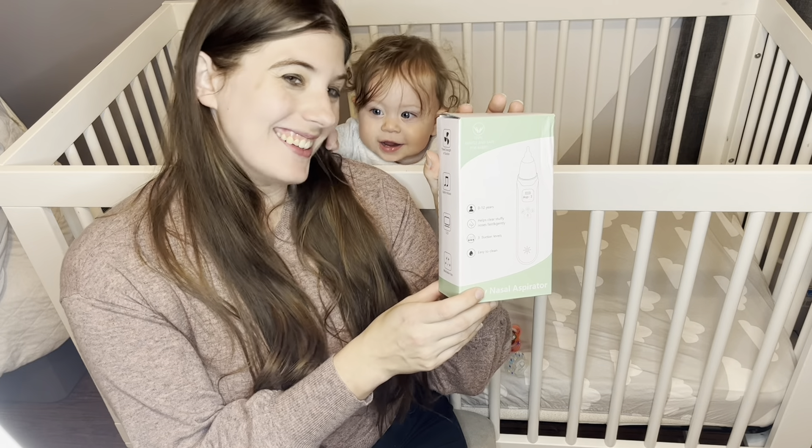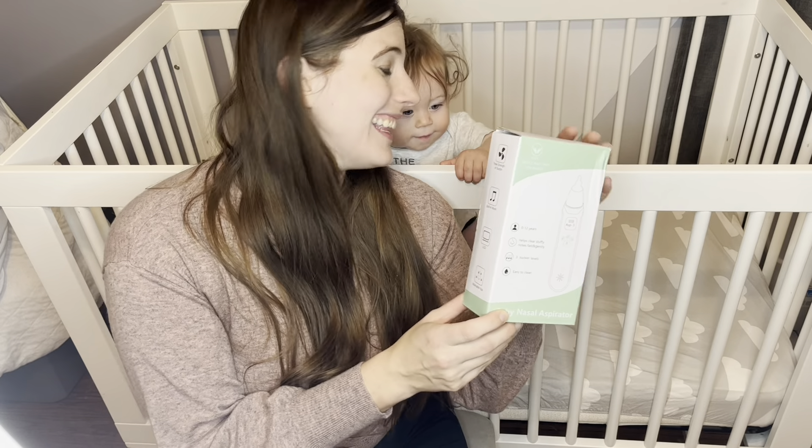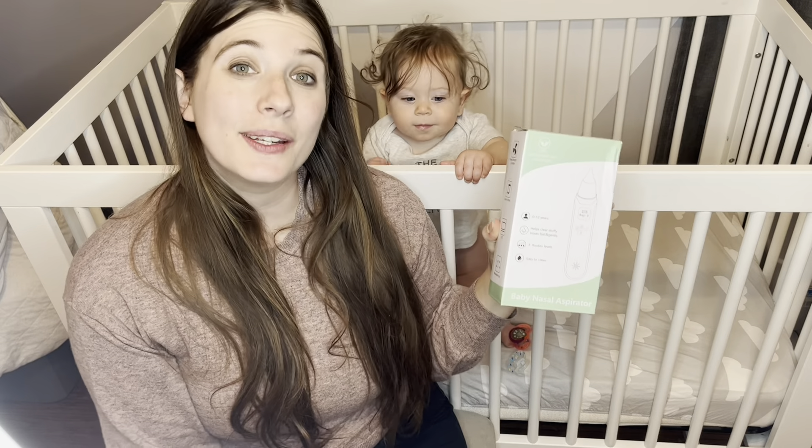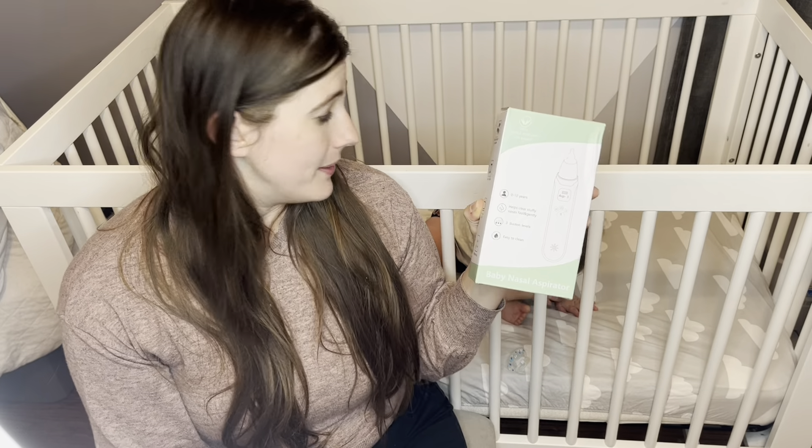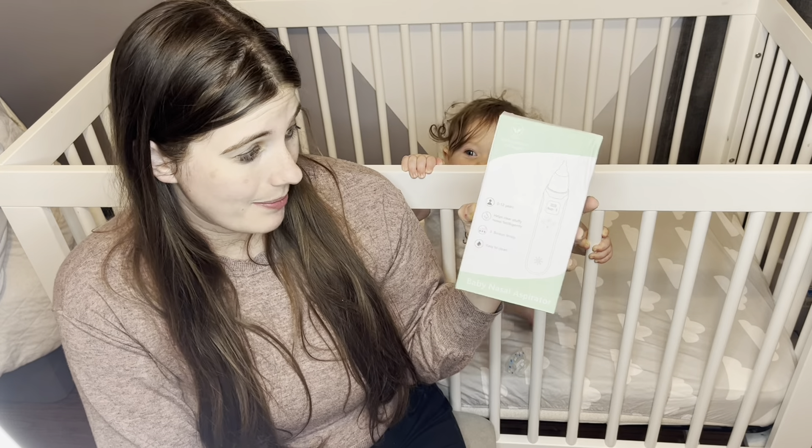Hi guys, I want to show you this new nasal aspirator I just got. I'm so excited to use it because it has three levels of suction and it's made with high-grade materials that are BPA and latex-free and so safe for my baby.